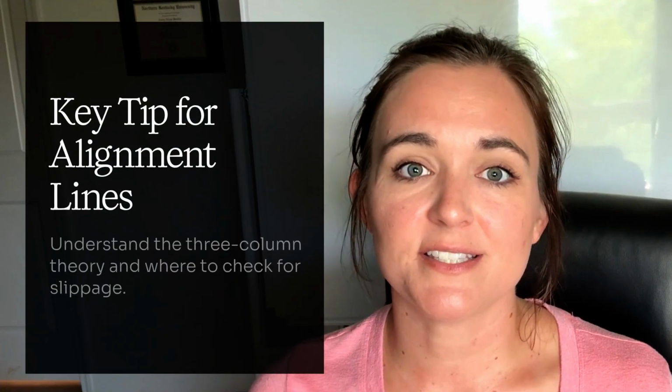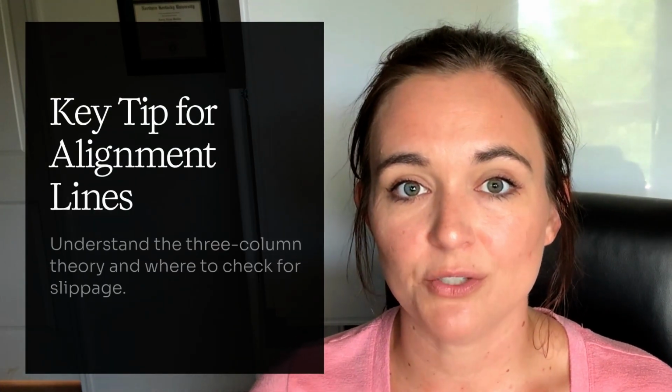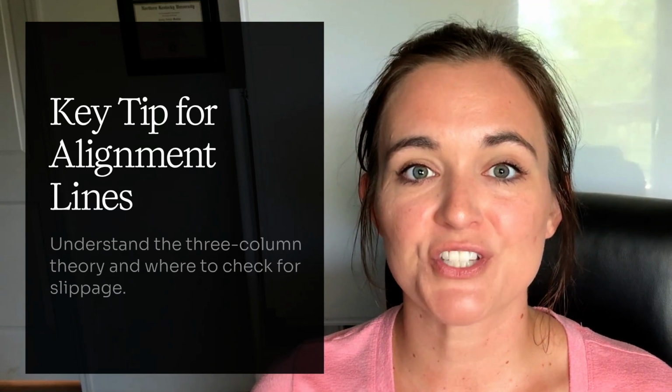Here's an ARRT style tip. They love asking about alignment lines in lateral spine views. Know your 3-column theory and where to check for slippage.